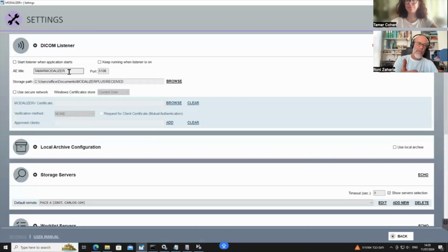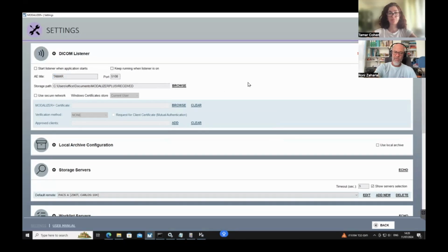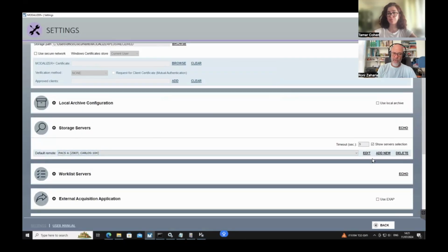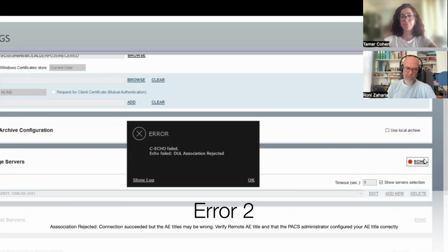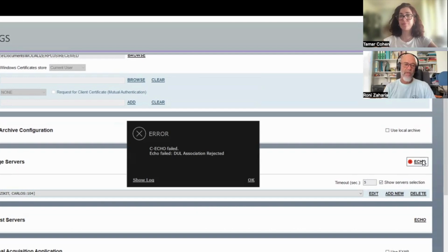If, for example, we have configured this in advance in our PACS, so it knows this application, but you change this and put something else, and then go to the echo in the storage server section and click echo, you see here you get a different error, which is "association rejected." This is different from not being able to connect. We are able to connect, but on the DICOM layer, when we compare the AE titles, the PACS says, sorry, I don't know you, or you have the wrong AE title.